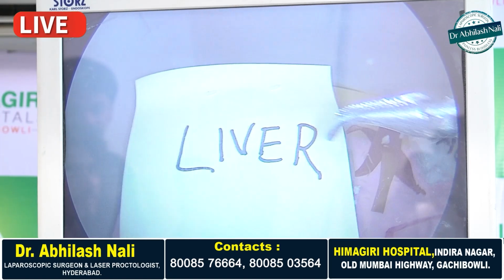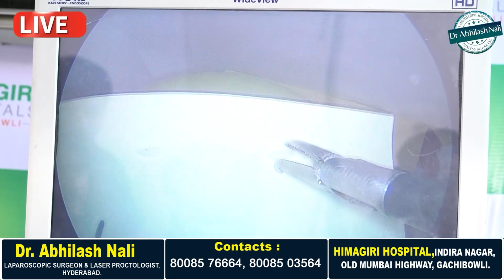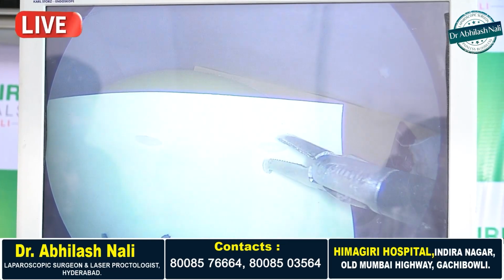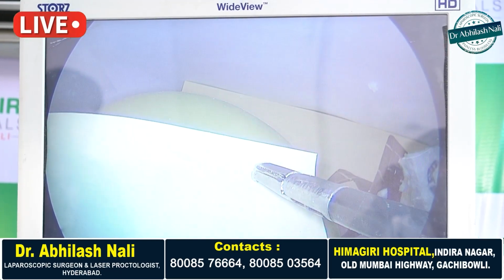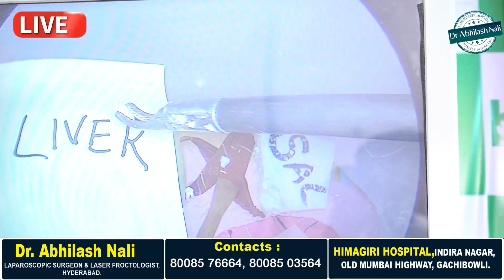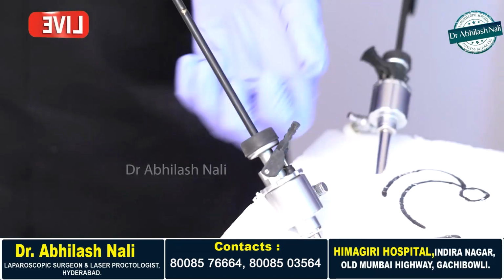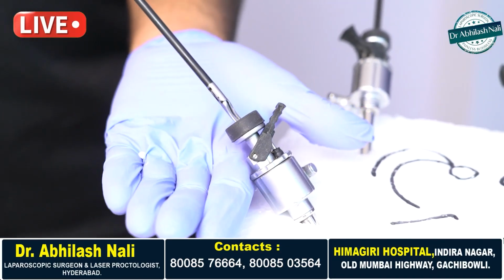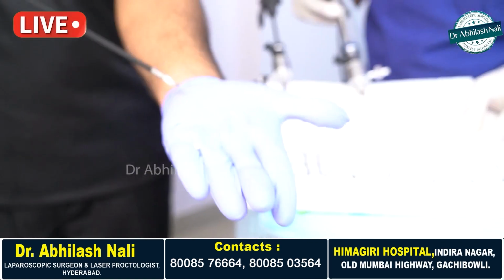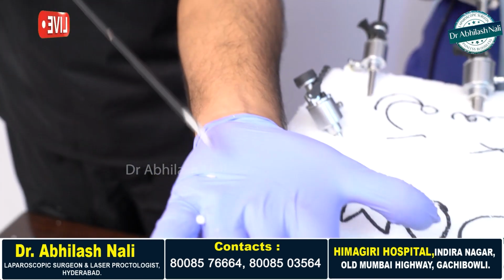For example, if we have to remove a small stone inside, through this camera and these laparoscopy instruments, we will be able to catch the stone. We will be able to catch small stones and remove them from inside. Now you can compare the advantages of laparoscopy over open surgery. So this is the stone removed.